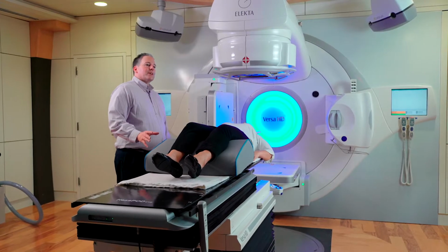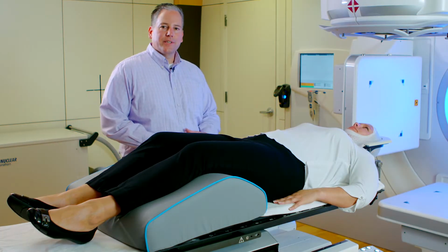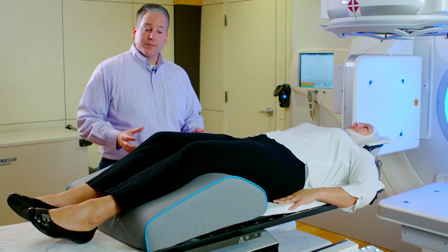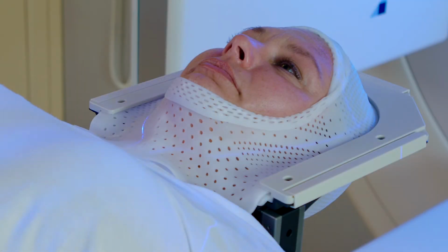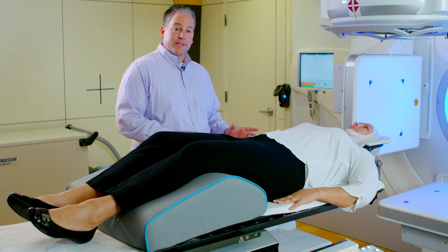So today we're going to go through the workflow process of using the Catalyst SGRT system to line up and treat a patient with SRS. As you see, we've got an open face mask patient on the table. We do want to use a nice open face mask where we can get a good view of the patient's face because we want to use the actual anatomy and not the mask itself.